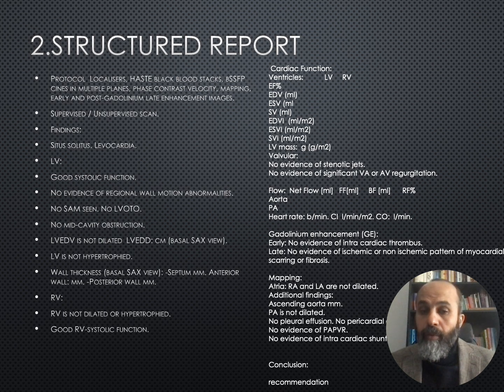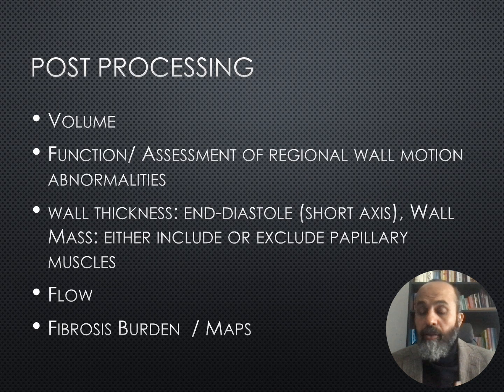Some colleagues will go by the sequences, starting with the localizer and then the cines, which are the backbone of any cardiac MRI, and later flows, if they have been done, and what they mean, the post-processing of the flows, is it valvular disease, or then maps maybe, or edema sequences, early gadolinium, late gadolinium, in order to reach a diagnosis. Both routes are fine and both should achieve the same goal at the end, either by organs or by using the sequences that you have performed.